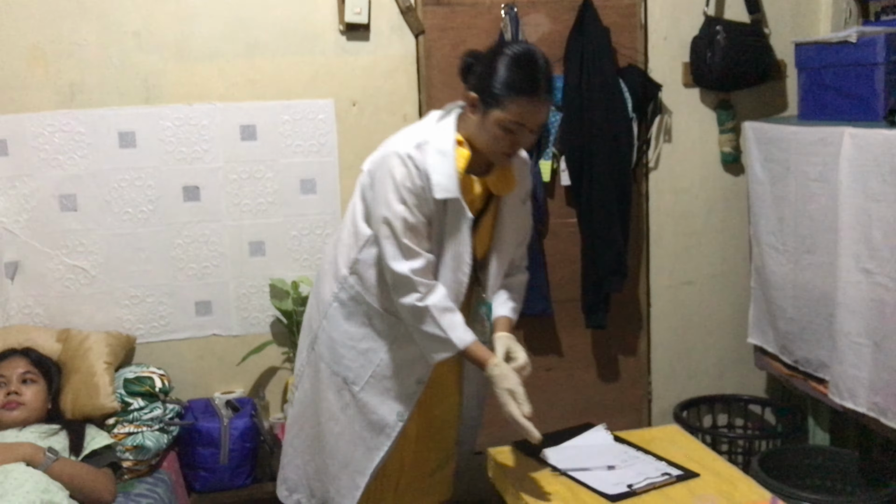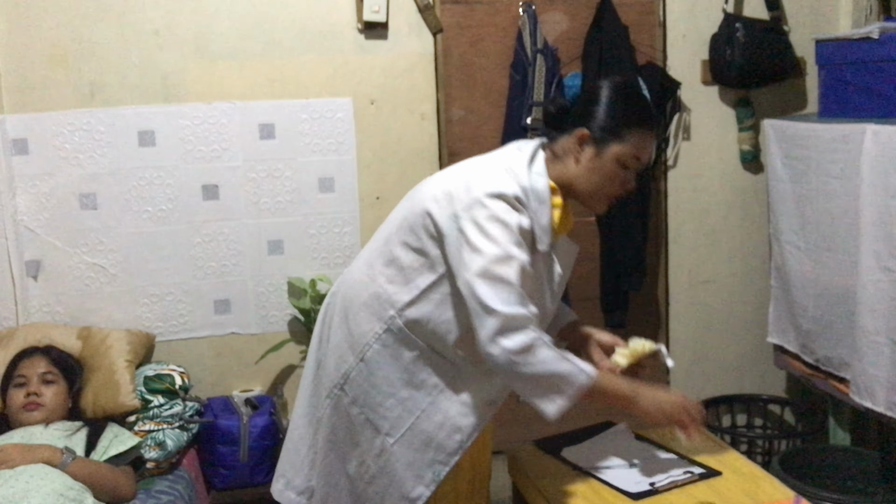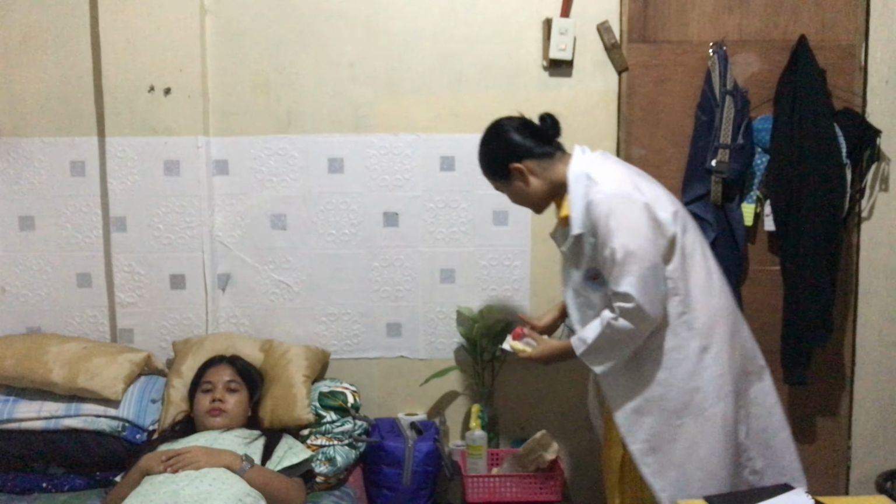This is the non-reusable, and the gloves are also non-reusable, and also the specimen because it contains the urine of our patient and it is already contaminated with bacteria. So I'll just put it here.